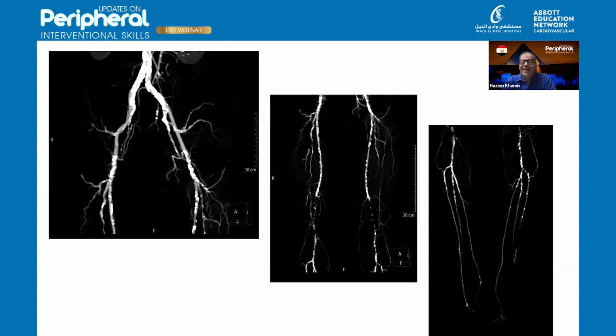Please stop. Sharif Kirdawi, what's your opinion? Yeah, it's a very interesting angiogram, but I think we have to combine it with the clinical examination of this patient. What I mean is, if I can feel a good femoral pulse, this means that it might... No, it was not palpable. This is very crucial. If I have a good femoral pulse, this might be an exaggerated image of the CT angio. But if I cannot feel the femoral pulse, this means this heavy calcification is fully present in this patient.